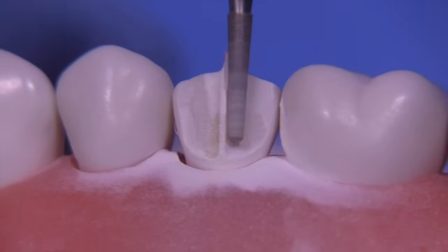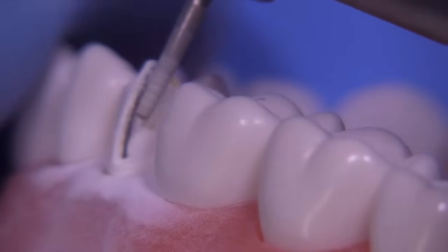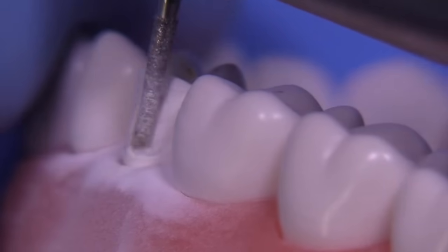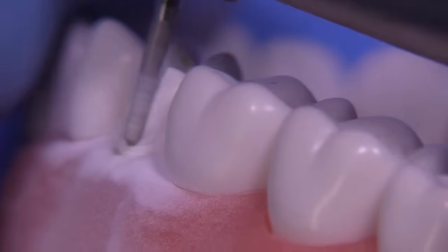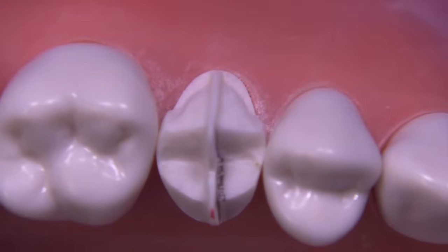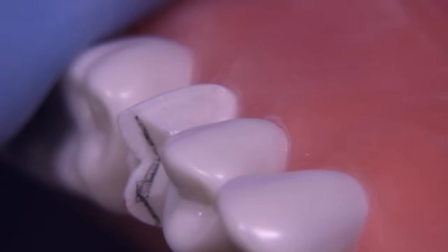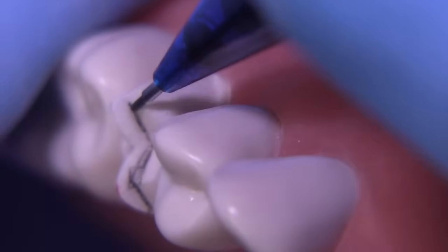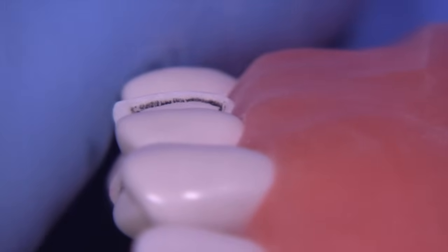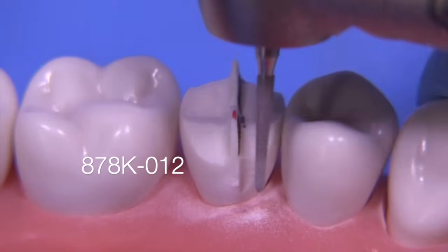Leaving that tenon really provides a lot of information about how to hold the bur as well. While holding the bur we're going to be angling it differently as we reduce the facial — more in a vertical manner near the gingival and a little bit more angled as we go up towards the occlusal. I'll draw on here so you can see the intersection between the tenon and the unprepared surface to get a clear idea of where you're under-reduced. You really couldn't do that so easily without the tenon in position.